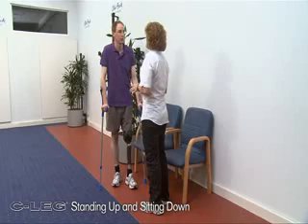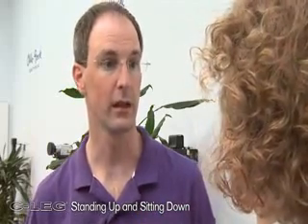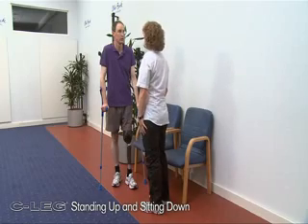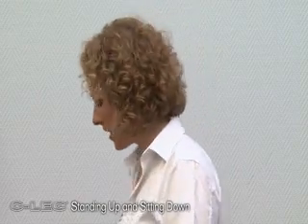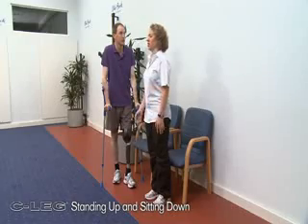The purpose of gait training is to get the patient used to the advanced functionality offered by C-Leg technology. Many prosthesis wearers take a little time to gain confidence. This is another reason why it is important to emphasize the safety factor here.